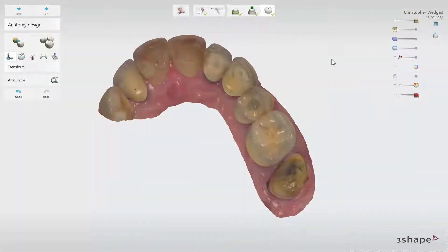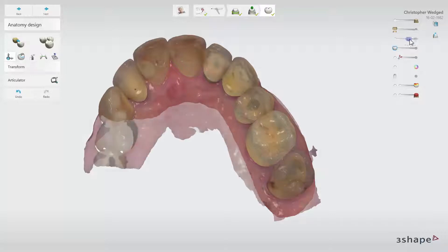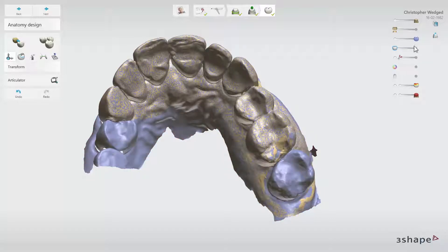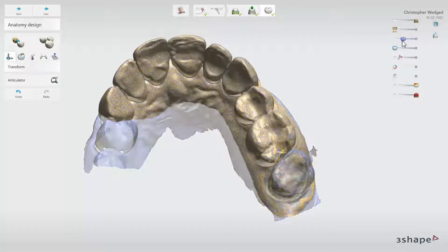While designing the restoration at the anatomy design step, there are two ways to copy the tooth from the pre-preparation scan. When a pre-preparation scan has been added, a new slider is shown on the right of the screen. When this slider is used, you can fade in and fade out the pre-preparation tooth. When there is no color on the scan, the pre-preparation is shown in blue.